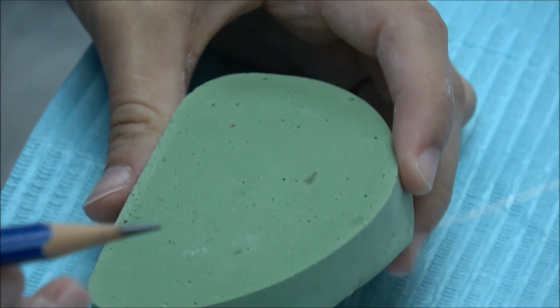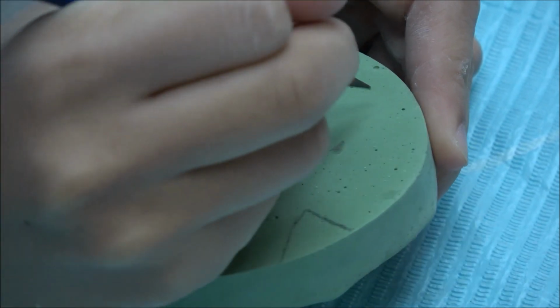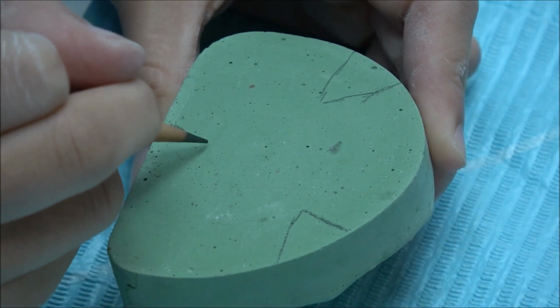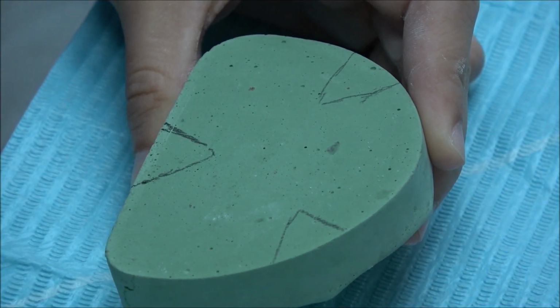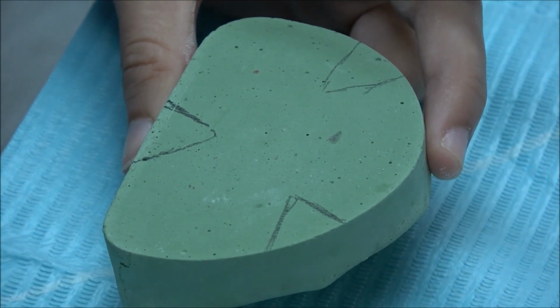We turn to the model base. We draw 3 lines, 3 notches here. Okay, and then we do the same thing. We are using our pink stone to trim it.